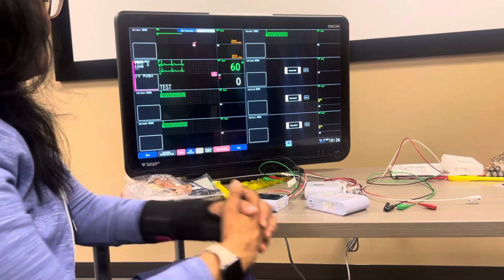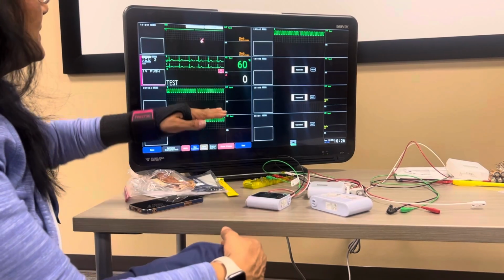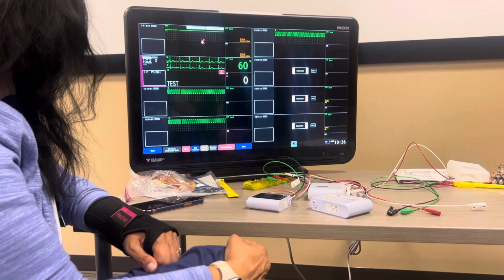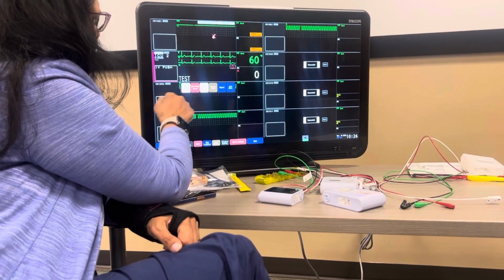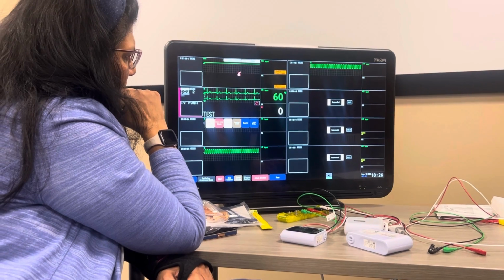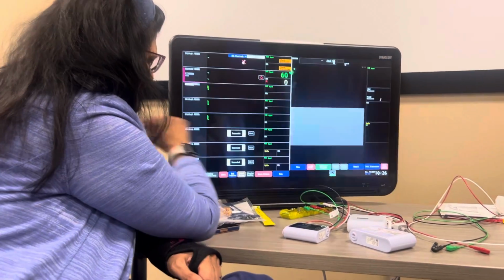Okay, what if I wanted to add, I forgot to put the room number on this patient. How do I add the room number? You're just going to hold that empty spot where the location should be. Is it just, like in the admit section maybe? Yes.